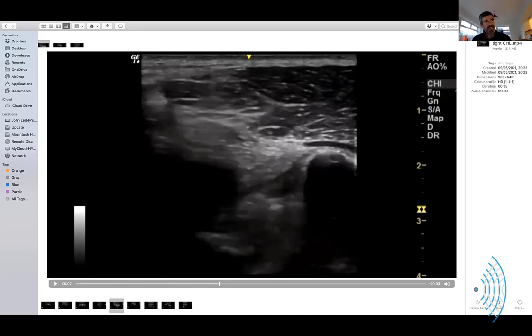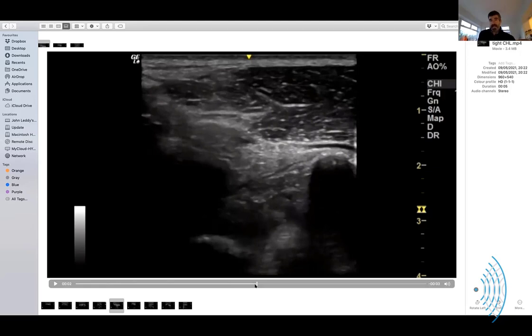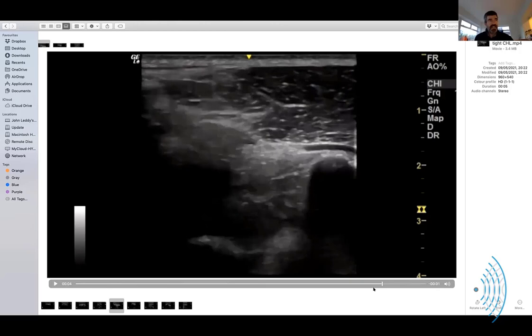So talk to me how far from the tip are you, John? Are you halfway from the tip of the coracoid en route to the clavicle, or where are you? Yep, you've got it as a finger, and you just come up it, and you know it's variable where you find it. And sometimes you do need to get the shoulder back a little bit on some patients, as well as externally rotating them. So he actually had quite, not a very thick, but quite a tight coracohumeral ligament.